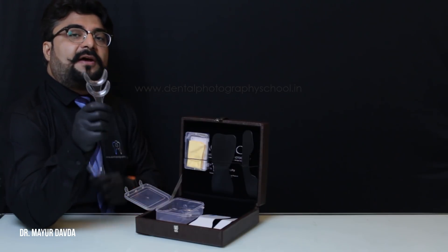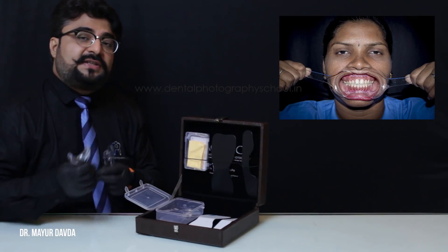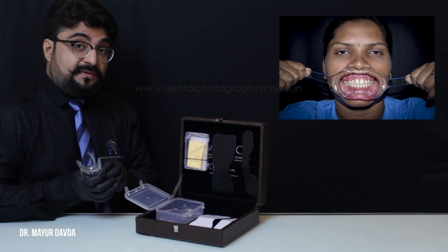Next we have a pair of C-shaped cheek retractors, which we use in maximum intercuspidation shots — retracting both sides. Make sure that the retraction is forwards and laterally.